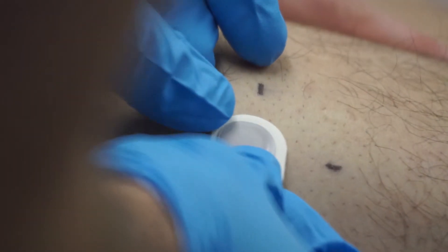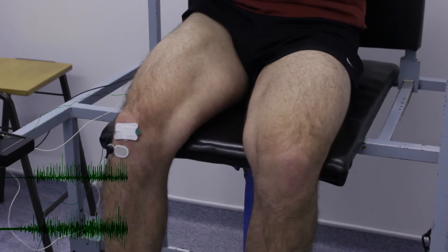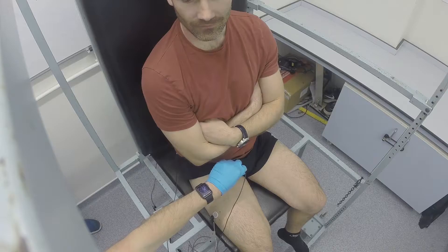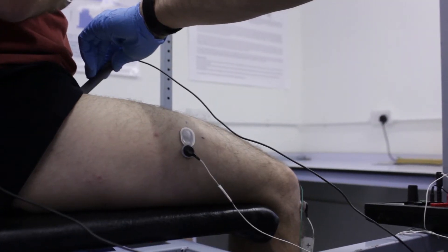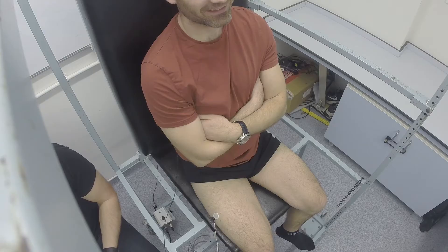Your volunteer can warm up by completing some moderate level contractions. Then measure maximal isometric force three times and record the highest. Apply supramaximal stimulation to the femoral nerve which passes through to the muscle. The electrical signal is recorded by the surface EMG electrode and is known as the Maximal Compound Muscle Action Potential or CMAP.